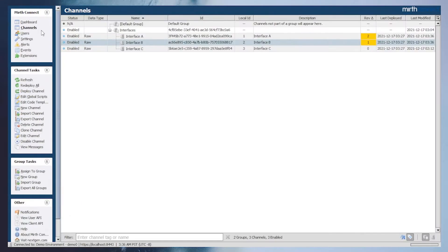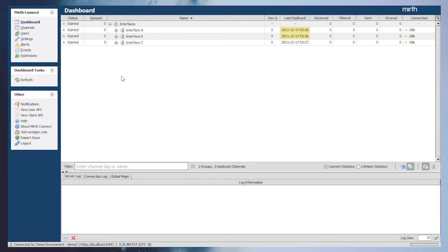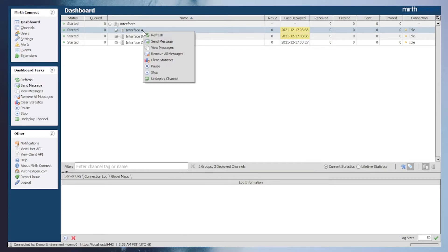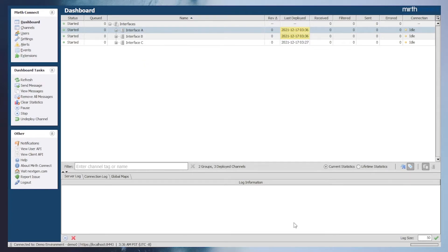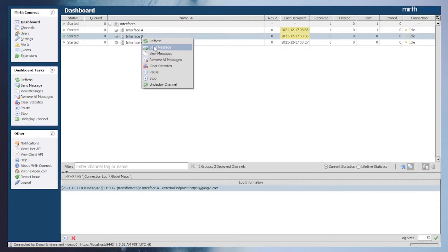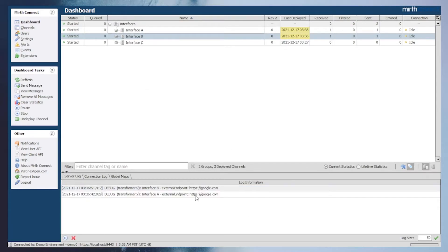Now to confirm our changes, we will deploy the instances and start sending across some test messages. We'll start with sending a message to interface A, and in the server log we can see that the configuration map variable is printed out, and in the message browser the interface successfully calls out to that value. Repeating the same with interface B, we can see that the same value is being printed out to the server log from both interface A and interface B.